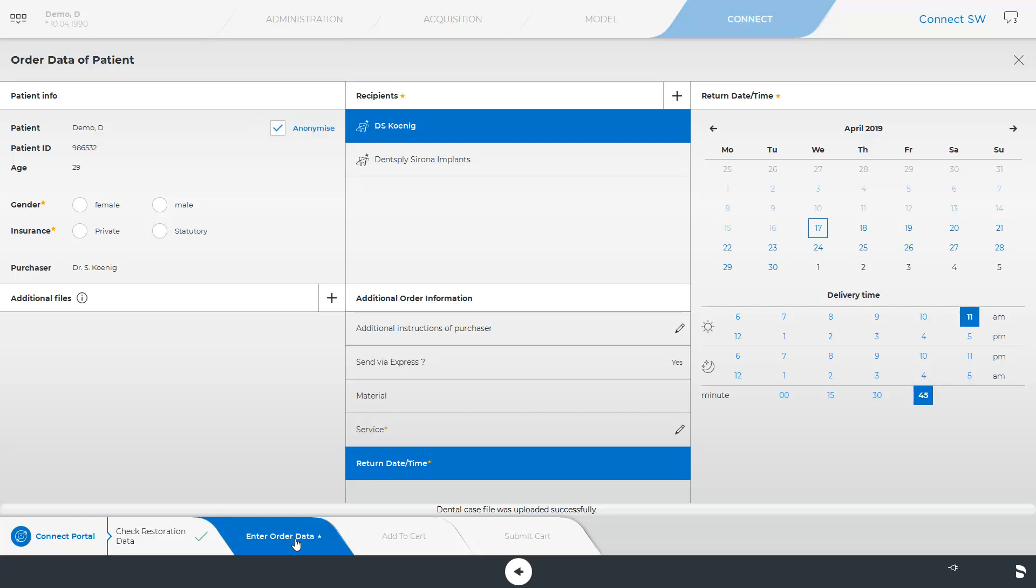A checkmark placed in the field Anonymize ensures that only an order number for this case is forwarded without any patient data. Next, we will go through all specifications in order to eventually send the case.